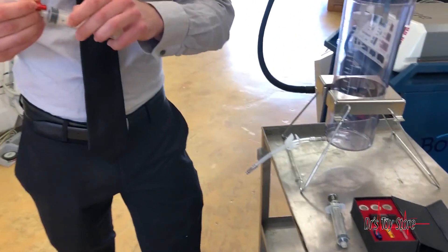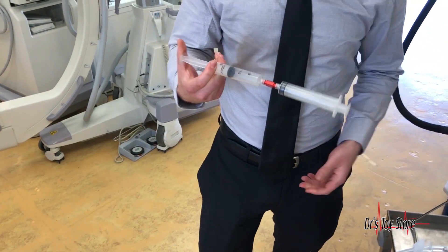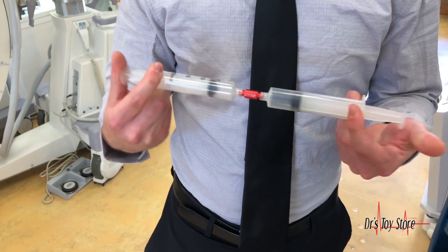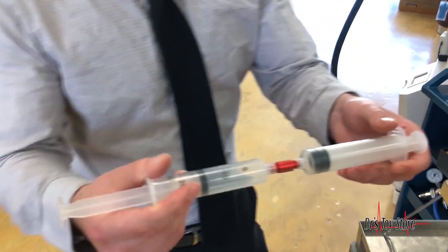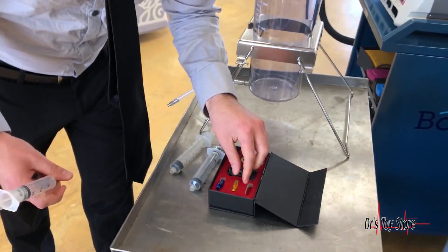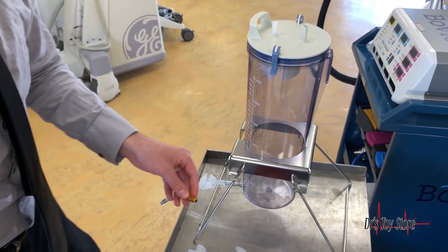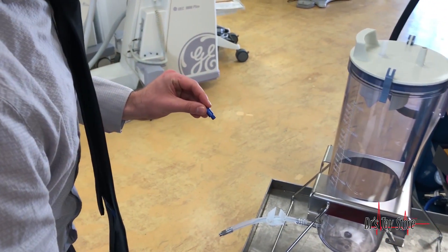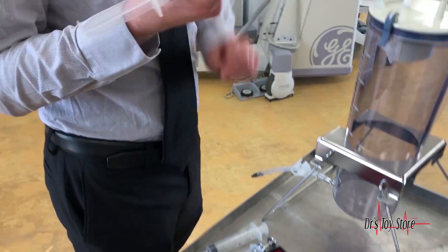You start your nano breakdown transferring, and this is done by going through 20 times back and forth. This is all manual so you have all the control in your hands. Then you take the final product and transfer it over to your 1.4 millimeter nano breakdown, and you do that 20 times as well.